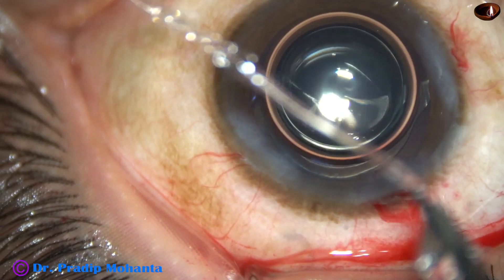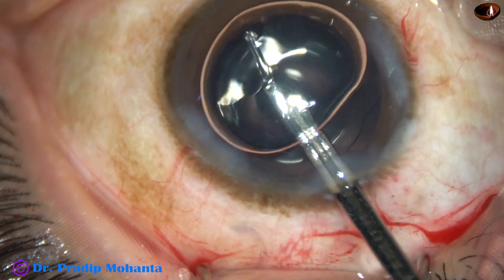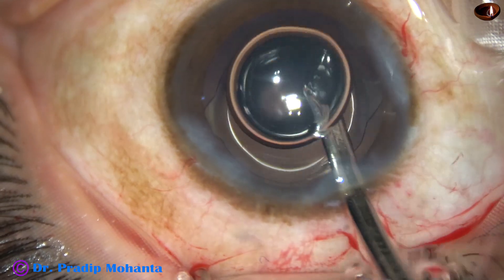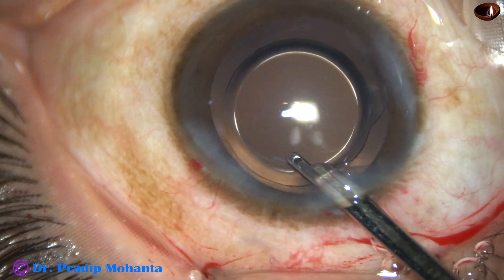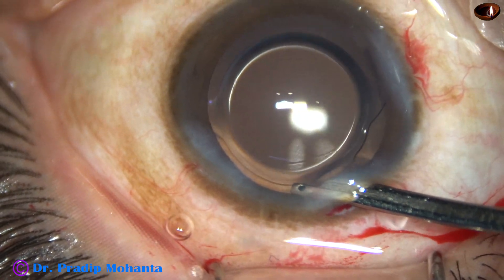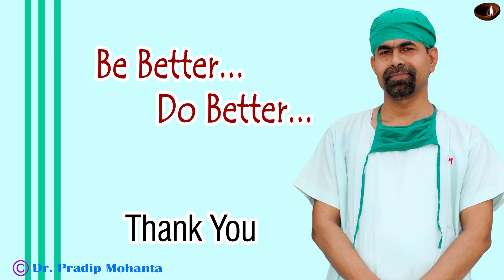Now I do a final lavage of the anterior chamber. The air bubble is removed, the anterior chamber is nicely formed, and the case is concluded. Thank you very much for your attention. I hope this video will help you in developing your surgical skills.